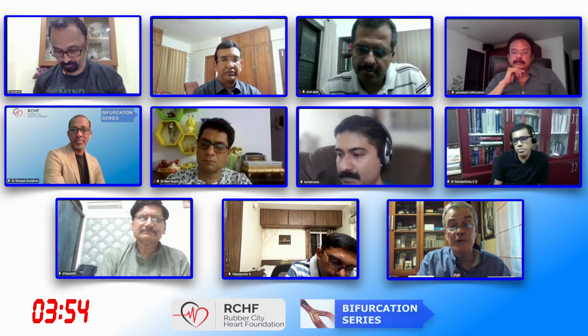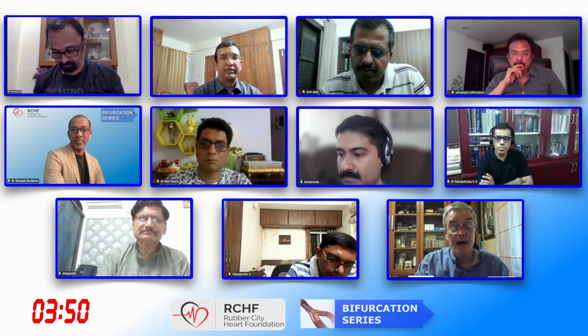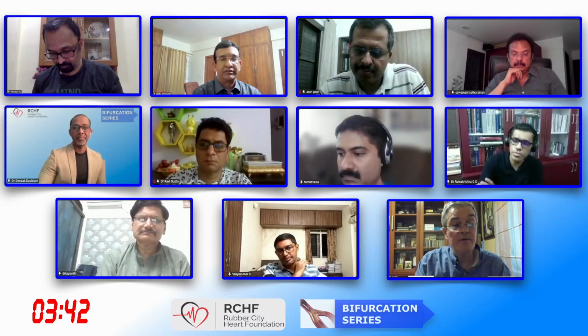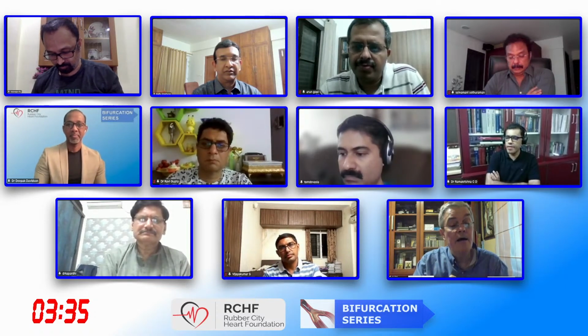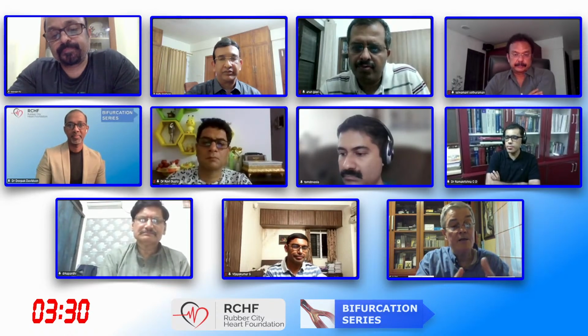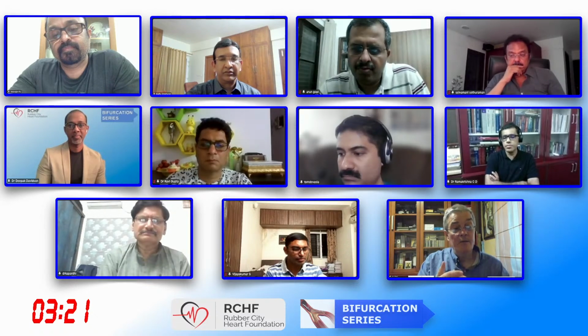But in case of diffuse disease, like in the first case from EBC2 which I presented, especially if you see calcium, I think it's wiser to do pre-dilatation before. If there is no clear calcium, I'm not convinced it's really always helpful, but if it's calcific, it's much more predictable to pre-dilate and prepare lesions, see how it opens before starting with the stenting.